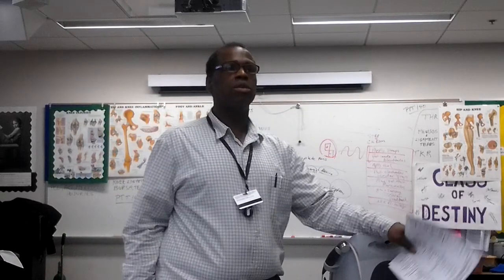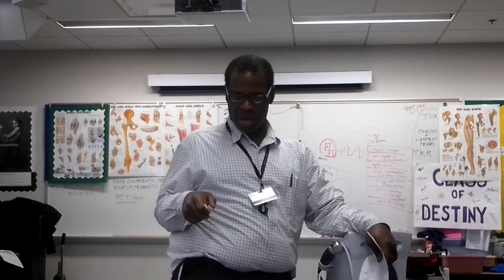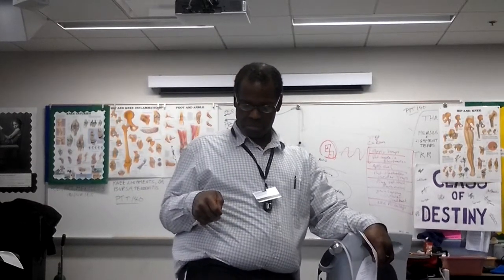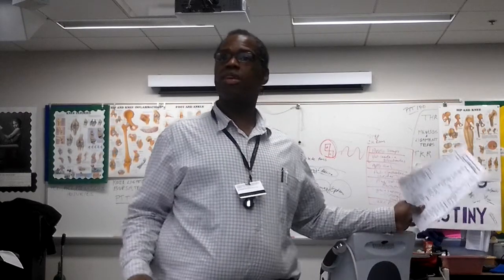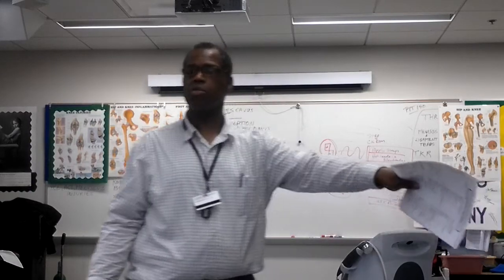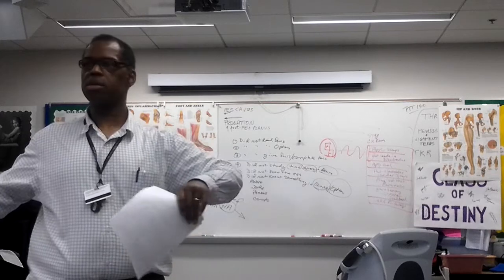Now, let's say that you're working with quad lag and you turn up the intensity and you get the lag to, I don't know, negative 10 degrees of extension. And they say, that's enough. That's enough. Stop. What can we do to get full extension? It can actively help, yeah. I'm going somewhere else. But that's good. Reposition, give me some more.